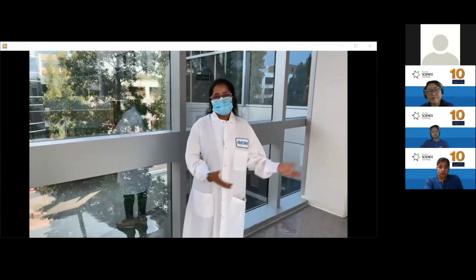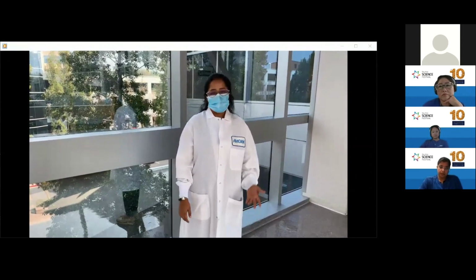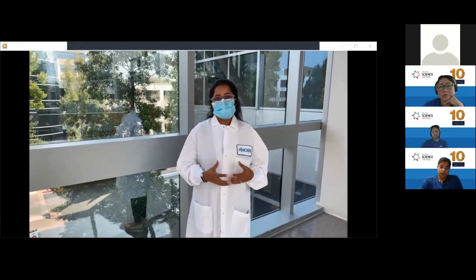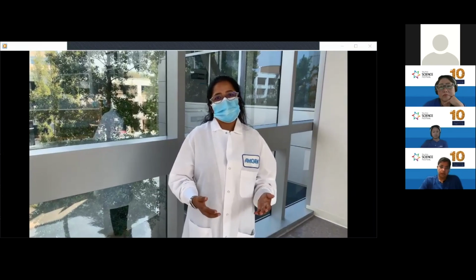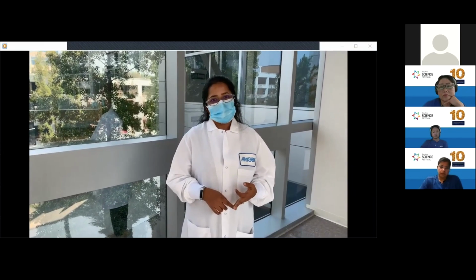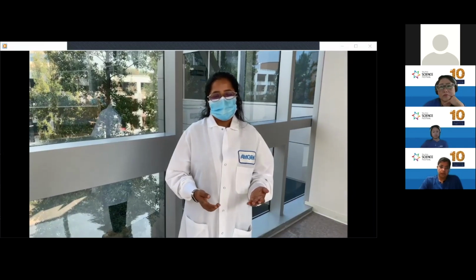Alright, so now we went through this process of tissue culture, and you might be wondering why we went through all this effort. So we actually do this on a very regular basis to test our drugs in vitro and in a way to see if they would work in the clinic. But in general, tissue culture practices have been used for vaccine development, sequencing of the human genome, and many other useful applications.